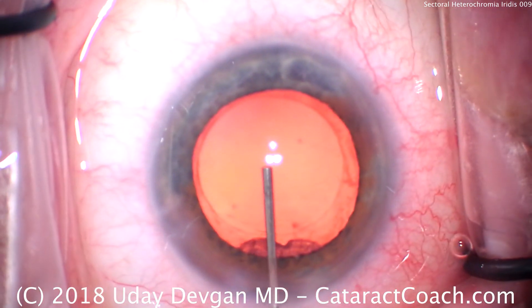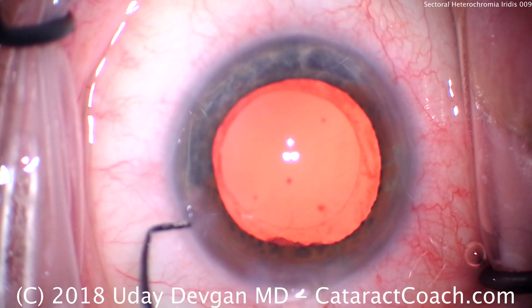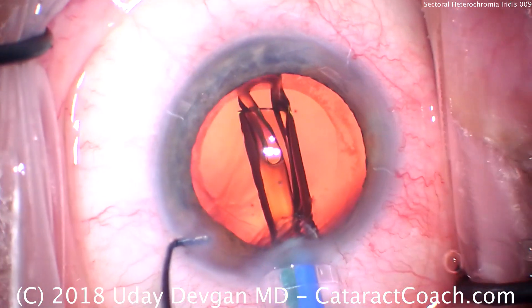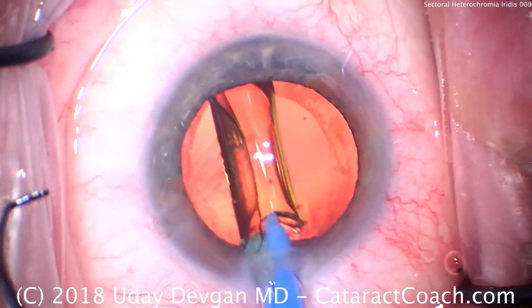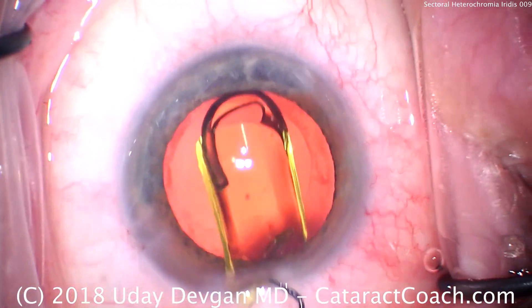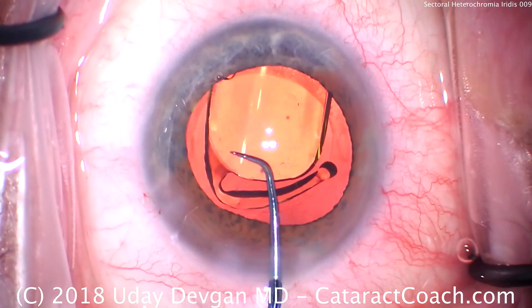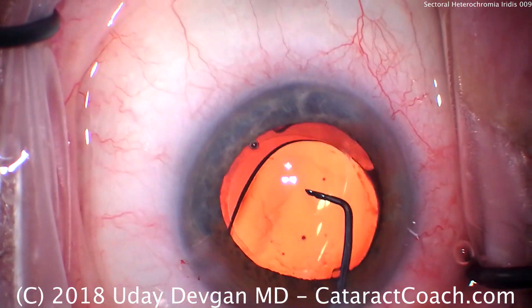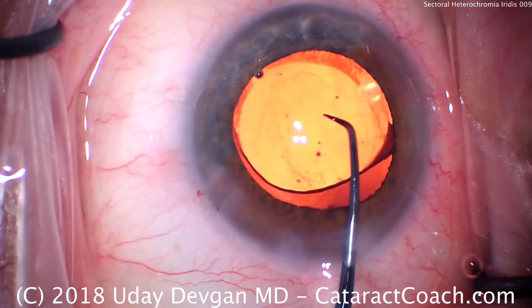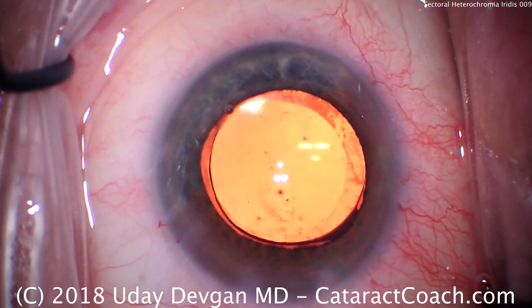There's filling the capsular bag with viscoelastic. We see our round capsular rhexis. Here comes our lens — this is a preloaded single-piece monofocal acrylic lens. We open it up; the leading haptic and optic are being placed in the capsular bag. The chopper is being used here to dial the lens the way we want it, so now the whole thing is going into the capsular bag. Here's an important step: rotate the lens in order to help free up that subincisional cortex as the haptic rubs across it.